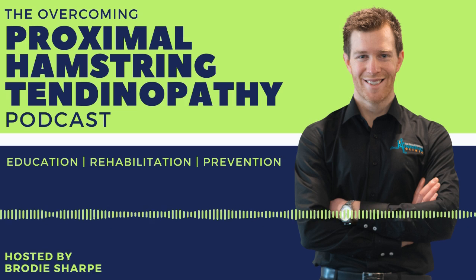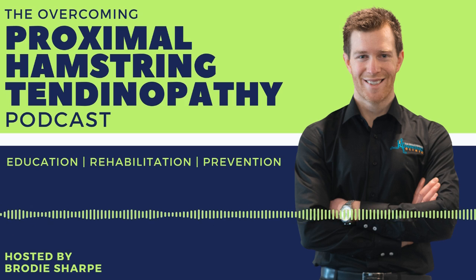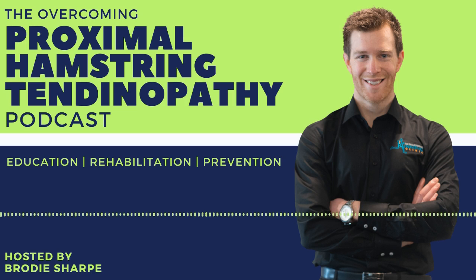So for me, the Shockwave is a part of the package, trying to get that tissue healing and then getting it stronger with your normal treatment. So it doesn't replace anything you've done. Because if you're giving Shockwave, it's very quick. It just takes 3 minutes. So for me, it's a very simple tool. You just give it for 3 minutes and then you do everything else you're doing. So it doesn't change your management massively, but it's a quick add-on just to kickstart the healing and get things going.